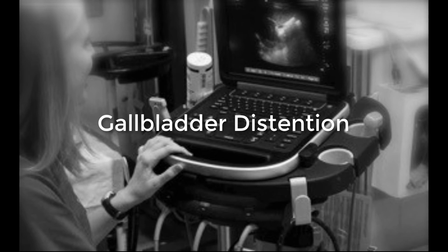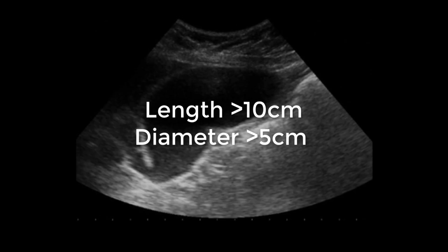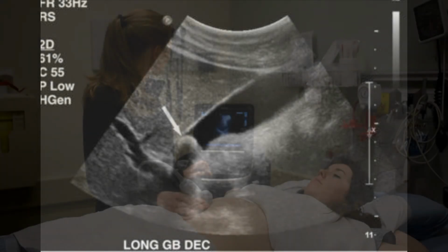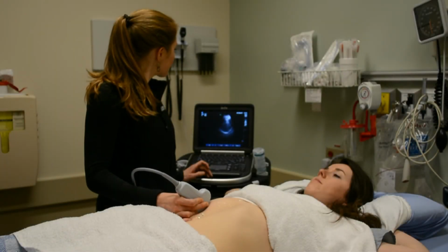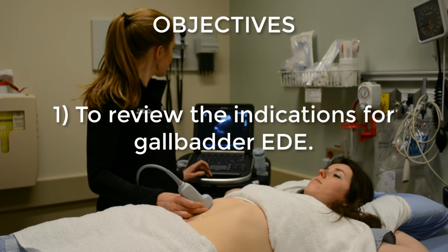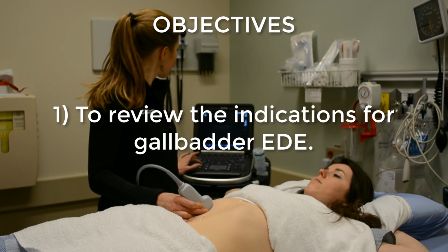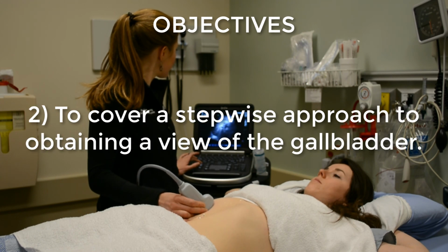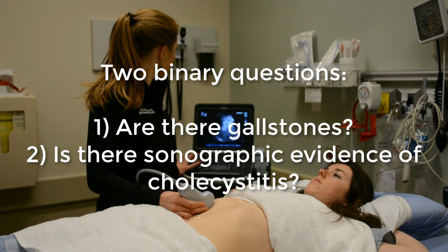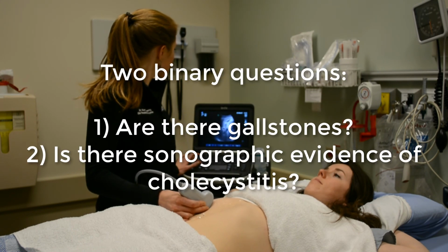And finally, gallbladder distension may be present when the gallbladder is more than 10 centimeters in length and more than 5 centimeters in diameter. This is a non-specific finding, but can be caused by an obstructing stone. That brings us to the end of this video showcasing a basic approach to gallbladder POCUS. I have covered the indications for the scan, a stepwise approach to obtaining an image, and image interpretation with a focus on the 2 binary questions of gallbladder POCUS.